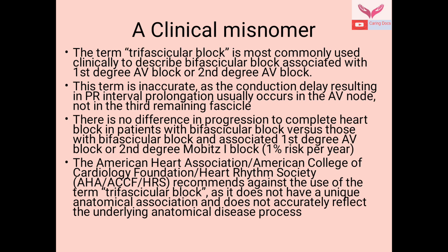Trifascicular block is also considered at times a clinical misnomer. It is most commonly used clinically to describe a bifascicular block when it is associated with first degree AV block or second degree AV block. This term is inaccurate as the conduction delay resulting in PR interval prolongation usually occurs in the AV node, not in the third remaining fascicle.